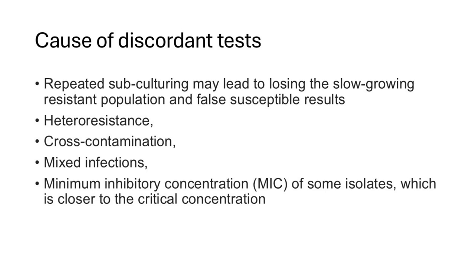Sometimes when you have open system PCRs, which your LPA is, you may get cross-contamination in the lab. There have been case reports of the bug being transmitted from the PPE kit that the technician is wearing onto the test and giving a resistance report.